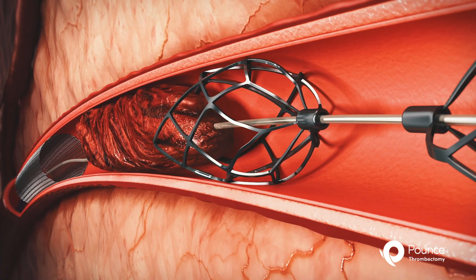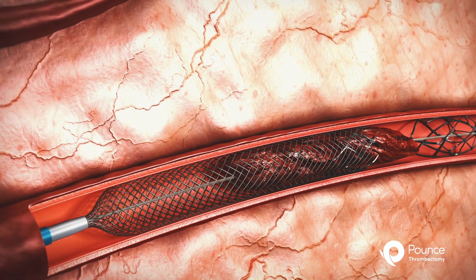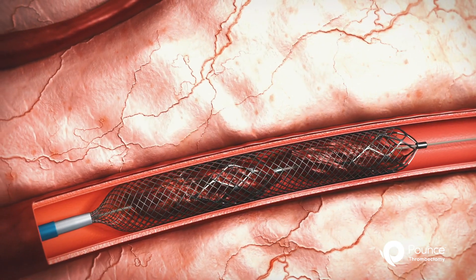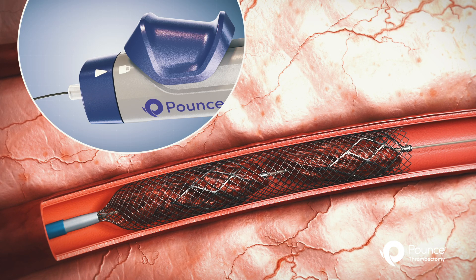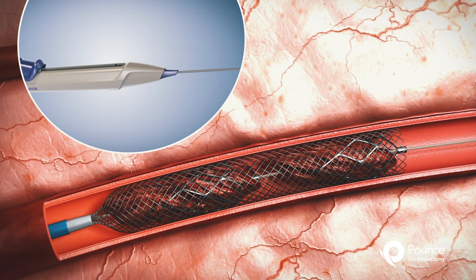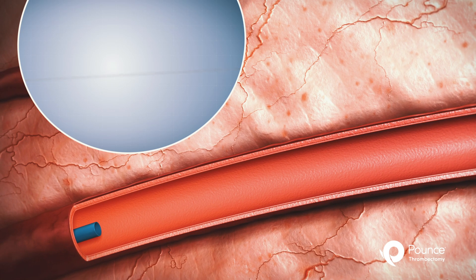The physician slowly retracts the dual baskets toward the expanded funnel, capturing the thrombus inside the funnel. The physician then rotates the wire lock knob on the proximal end of the integrated handle to the locked position. To maintain basket wire position in the funnel during thrombus or embolus removal, the physician pulls the funnel catheter, which contains the baskets and captured clot, until it's inside the procedural sheath.